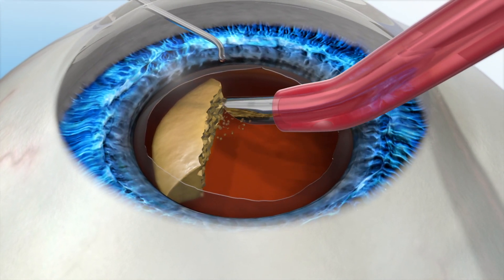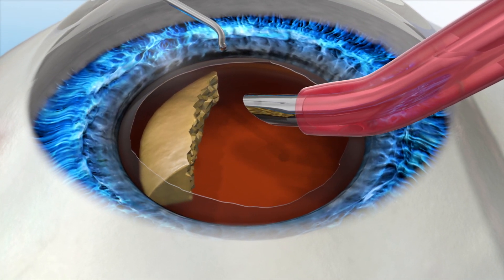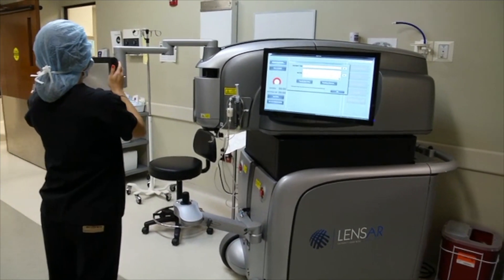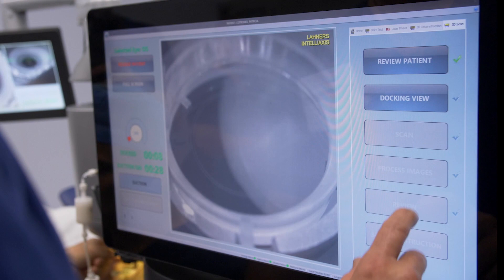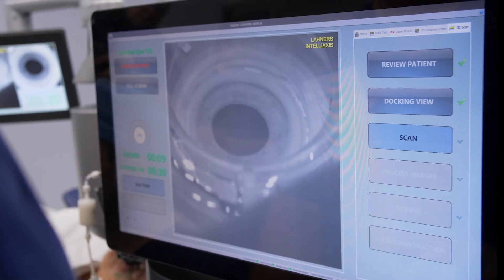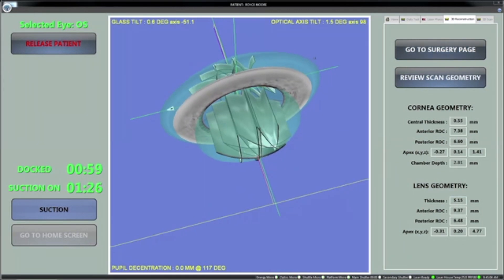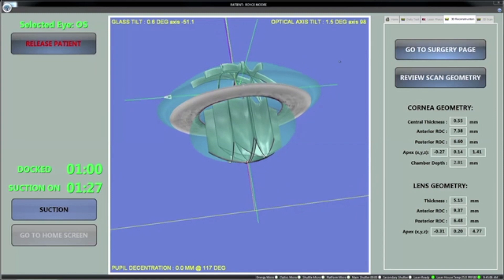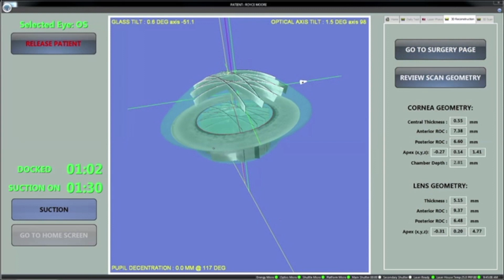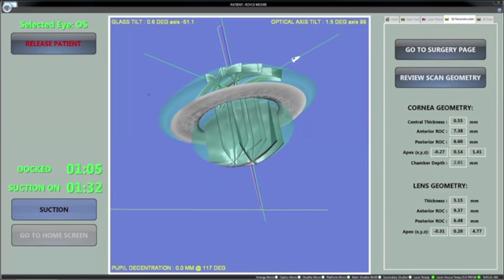After the cloudy lens is removed, a new IOL is placed into the capsule where your natural lens used to be. Opting for a laser cataract procedure with the advanced features of the Lenzar laser system provides more precision and accuracy during the critical steps of the procedure. The Lenzar laser system's advanced augmented reality technology is a unique imaging system that provides your surgeon with a 3D view of your eye, allowing for more detailed information and treatment choices during your cataract removal procedure.